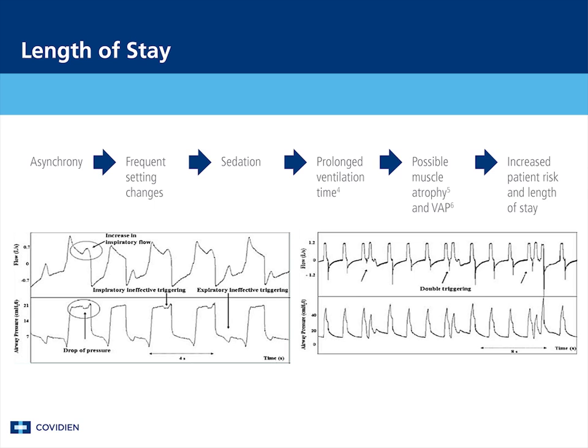Because patient conditions are constantly changing, frequent manipulation of the ventilator settings is required to manage the asynchrony. It is not uncommon for patients to be sedated as a result of asynchrony, and this has been shown to prolong ventilation time. Furthermore, prolonged ventilation time may result in rapid atrophy of the diaphragm and ventilator-associated pneumonia. The end result can be increased risk to the patient, increased length of stay, and higher associated costs.